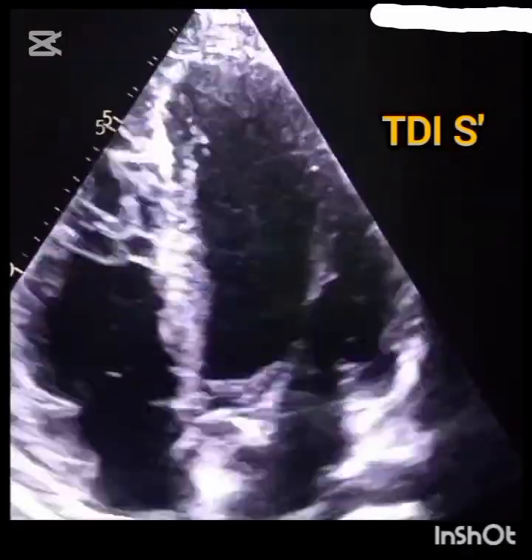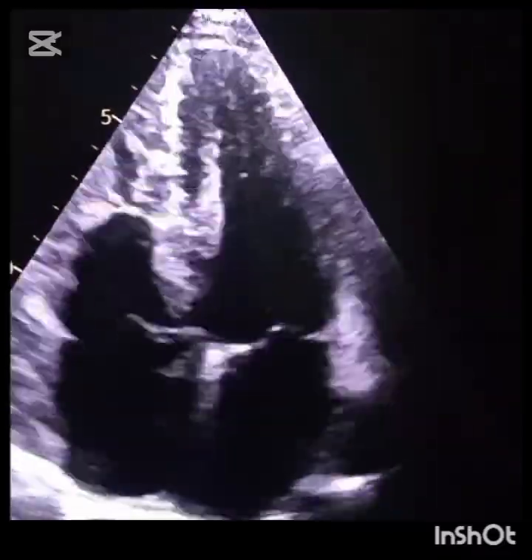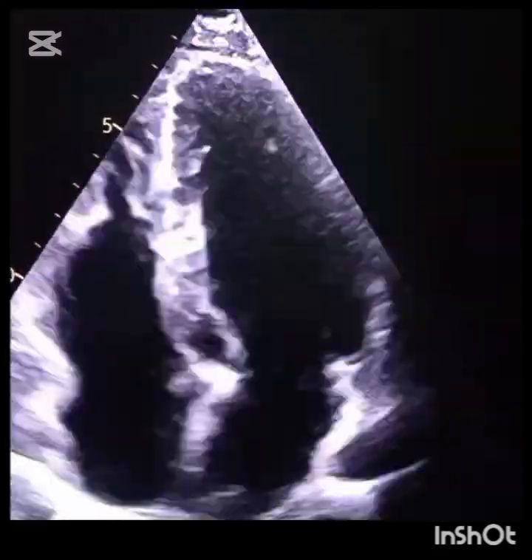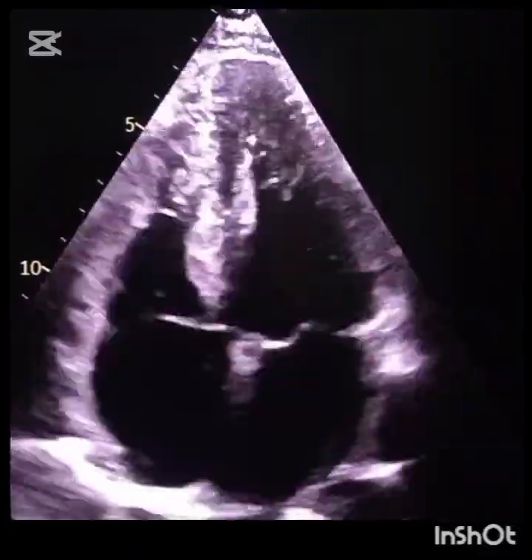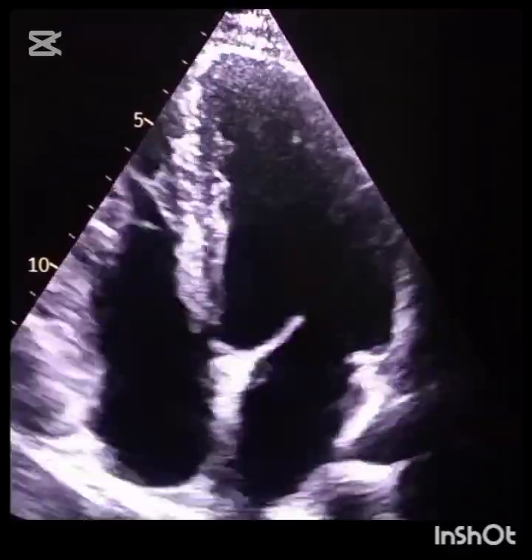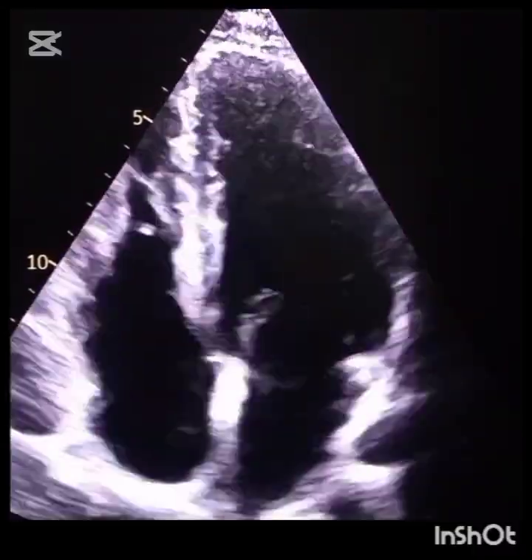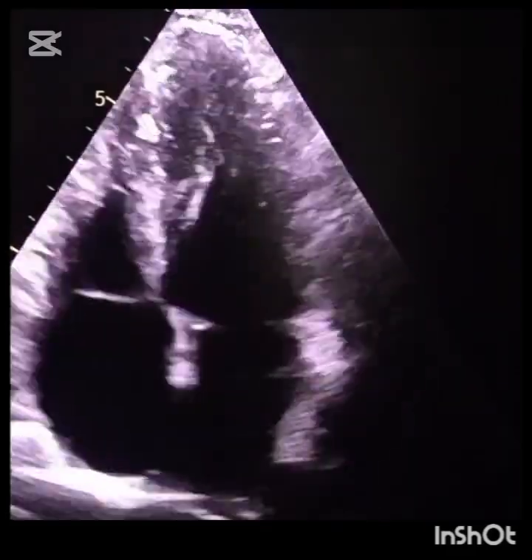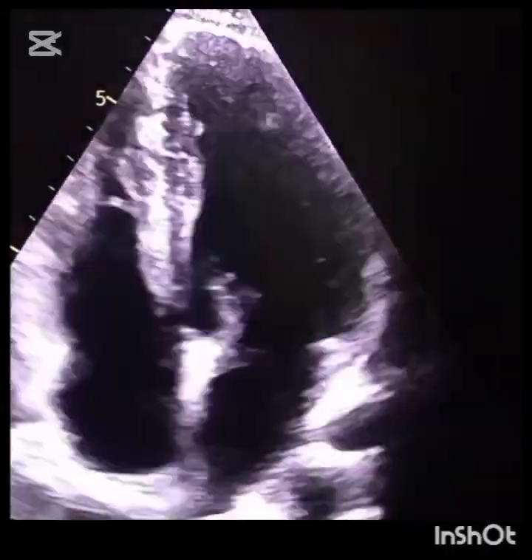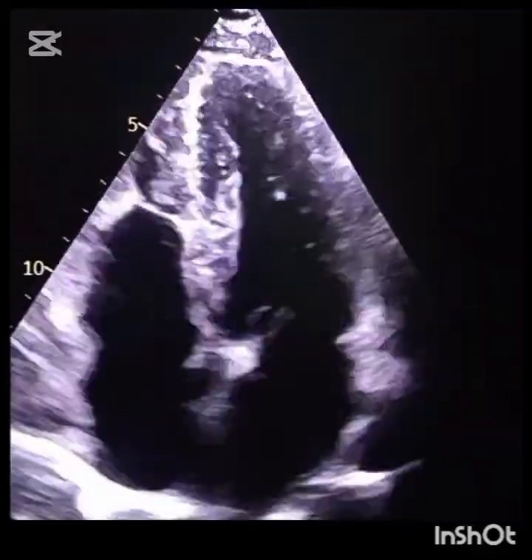The second parameter is the TDI S' wave — tissue Doppler imaging velocity. TDI S' wave is used to assess right ventricle systolic function just like TAPSE, but instead of measuring displacement distance, it measures the velocity or speed of the tricuspid annulus during systole. It tells how fast the tricuspid annulus moves toward the apex when the right ventricle contracts. The TDI technique detects the velocity of myocardial motion, not blood flow. When the right ventricle contracts, the lateral tricuspid annulus moves toward the apex, generating a positive systolic wave on the Doppler tracing called the S' wave. The higher the S' velocity, the better the right ventricle systolic function.